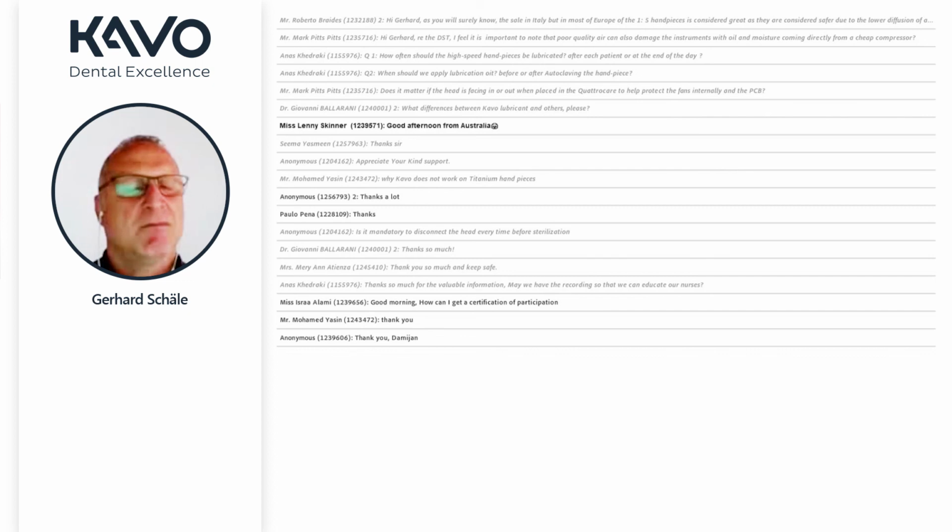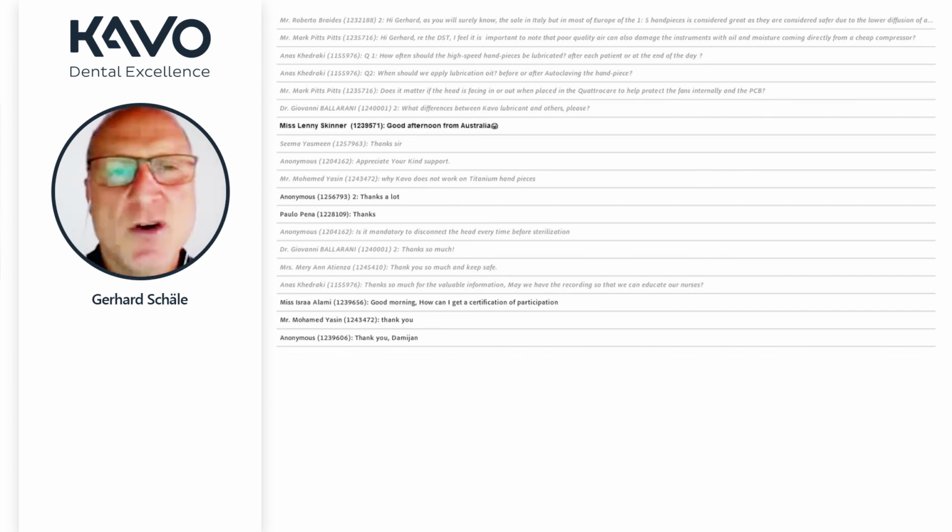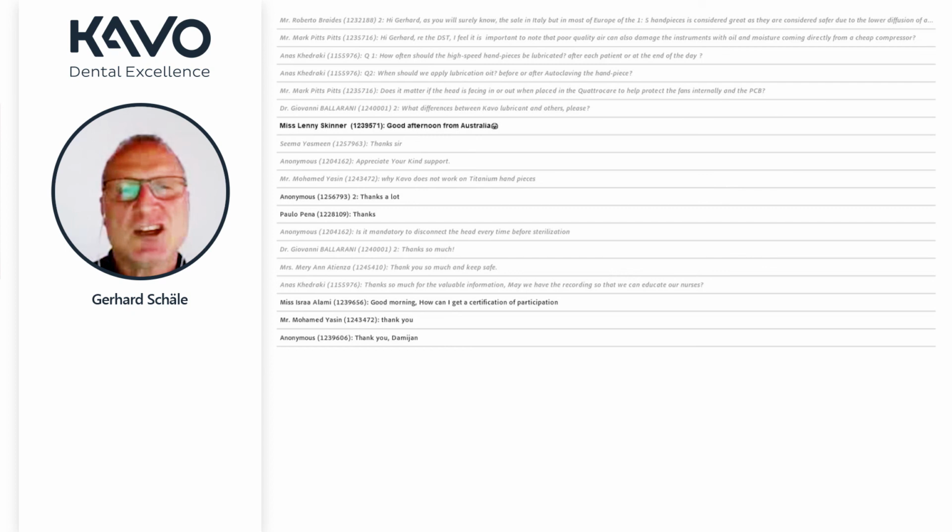So you don't remove it, because therefore you should have a special tool to remove it, and this special tool is only needed for the service technician, only in the case when the instrument will be serviced. But all instruments which do have a fixed head, the fixed head will stay on the instrument. Only for the master series, where you can interchange the heads, you can take it off for the cleaning. You can place it separately for the sterilization.